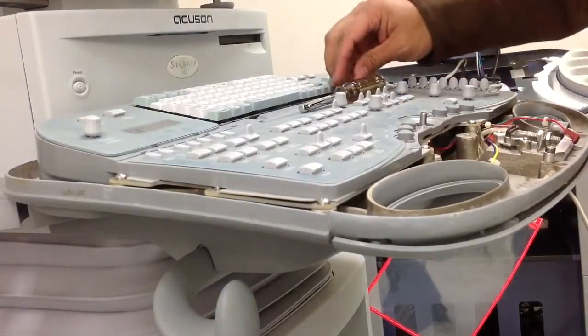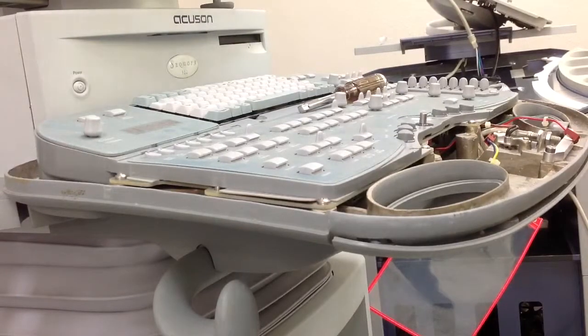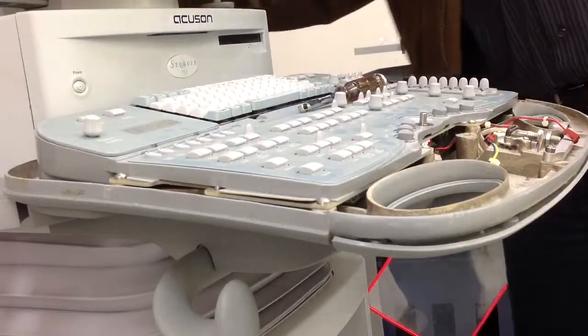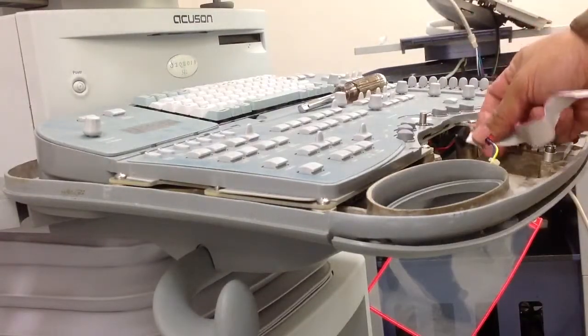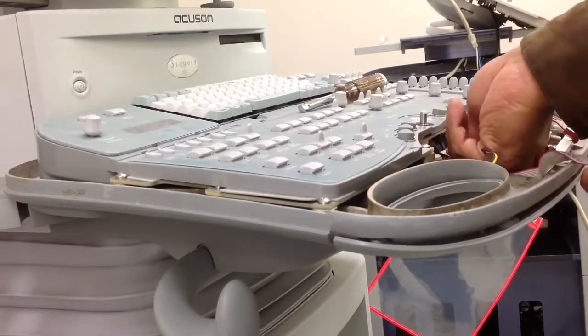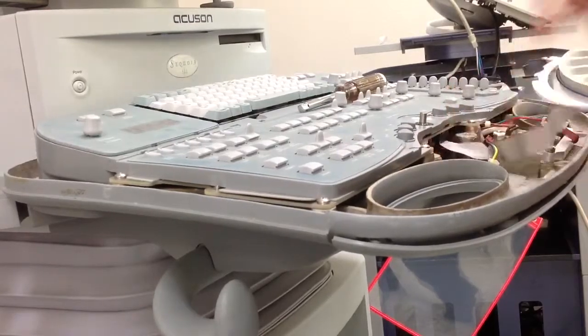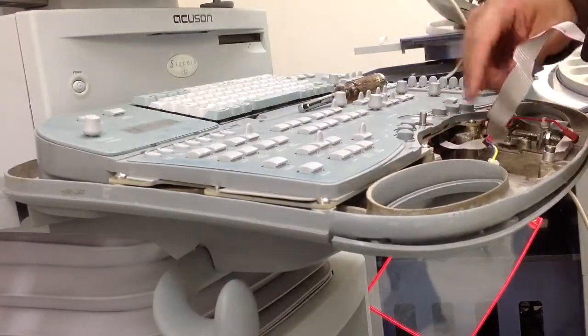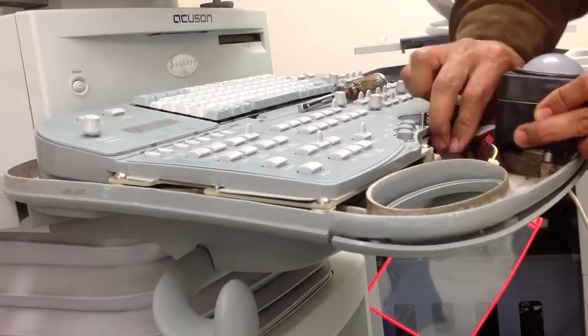Okay, now the trackball. When you put the trackball, put the cable first. Make sure the cable is set properly inside.